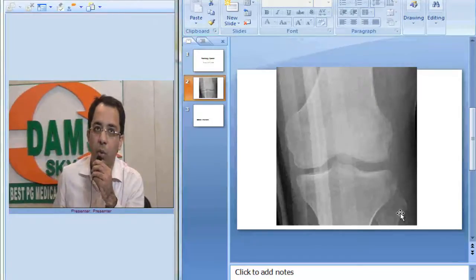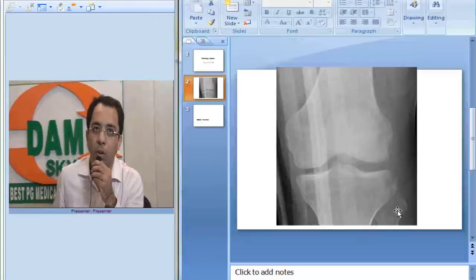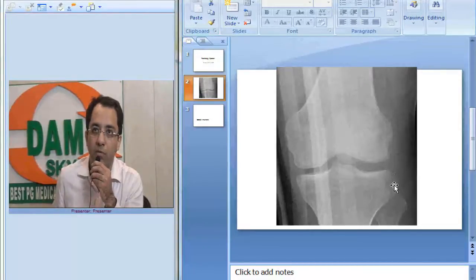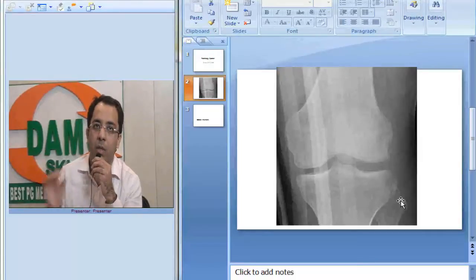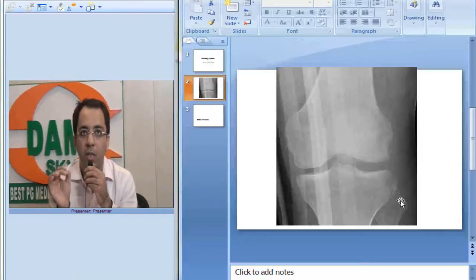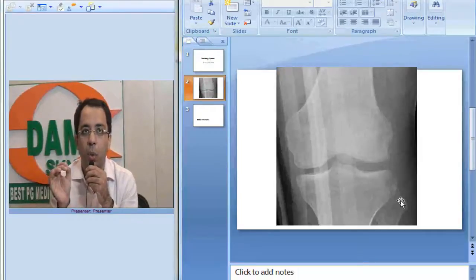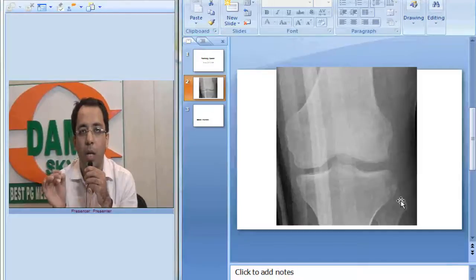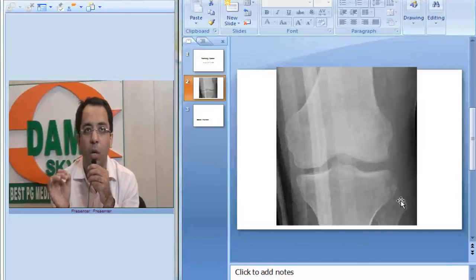Now, I want you to take a careful look at the lateral part of the tibial condyle. This is the lateral side. Can you see a fracture here? This classic fracture located at the lateral tibial condyle has been called the Segond fracture.